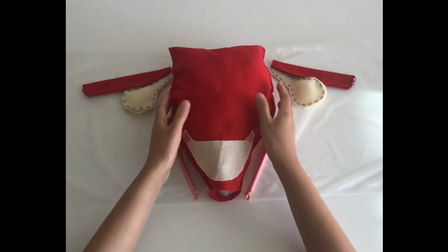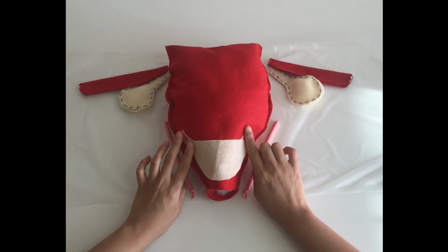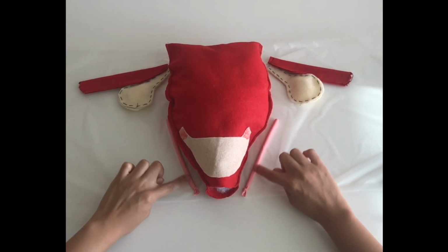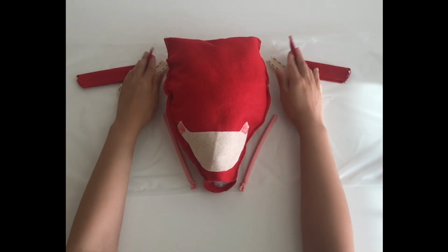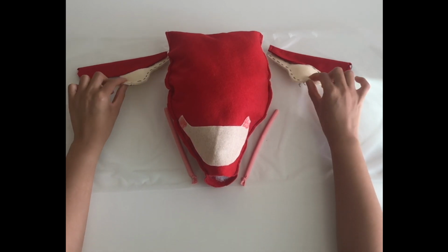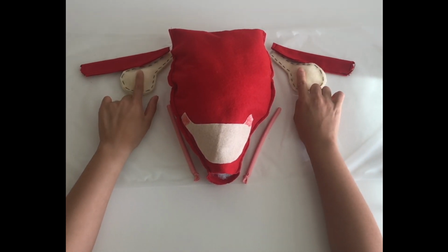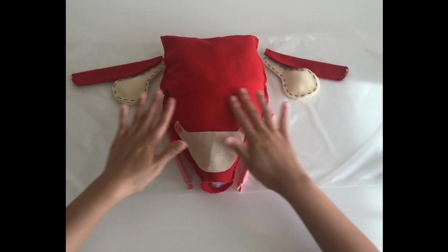You will have the uterus in the middle, the bladder shape on top of the lower uterine segment, the uterine arteries up on each side of the uterus, 2 fallopian tubes at the cornua of the uterus, and ovaries on each side as well. A second sheet of food wrap will be placed on top to surround the surface of each shape.